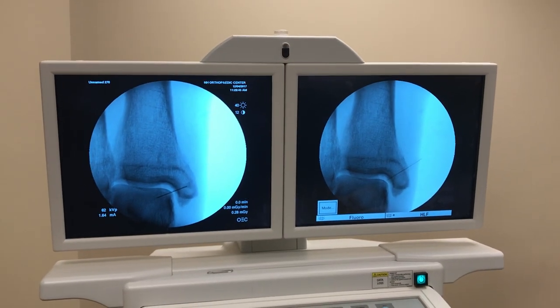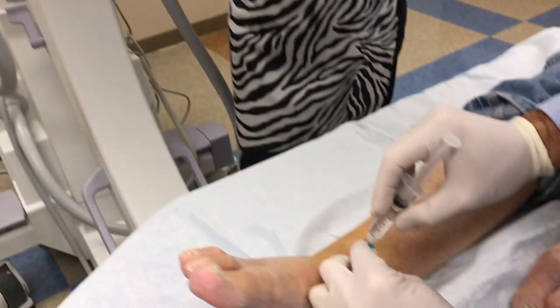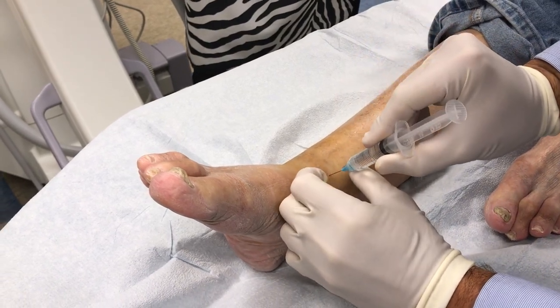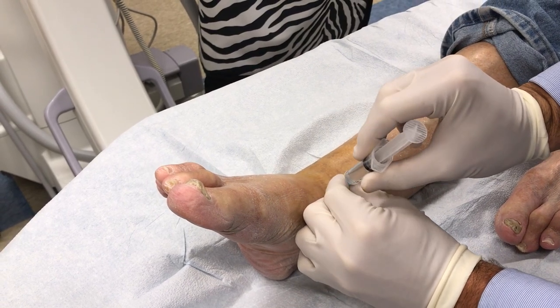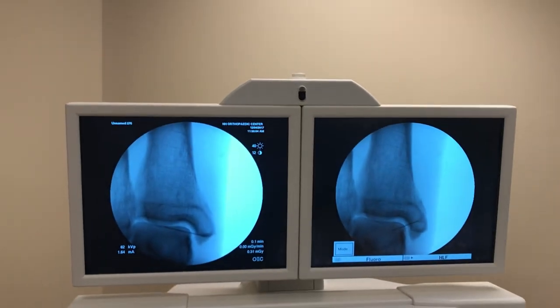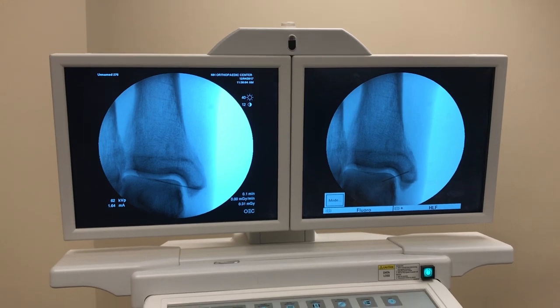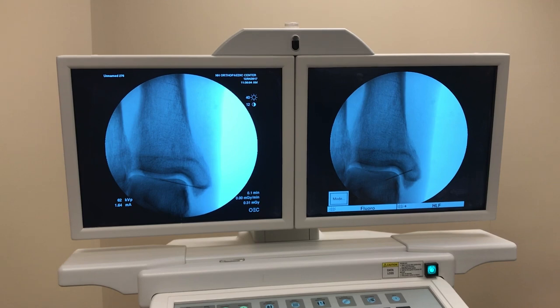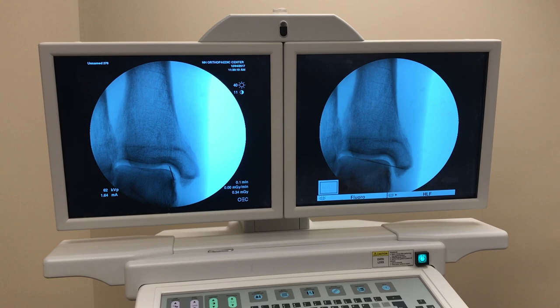I can see I'm too distal there, so I'm going to move my needle proximal. I'm going to straighten that out just a little bit — there's a bit of an angle there, so I'll straighten that out. X-ray there — that's better.